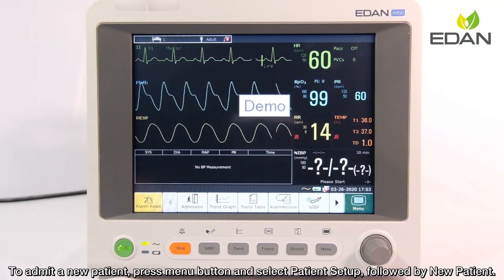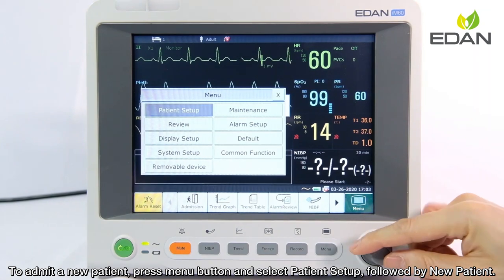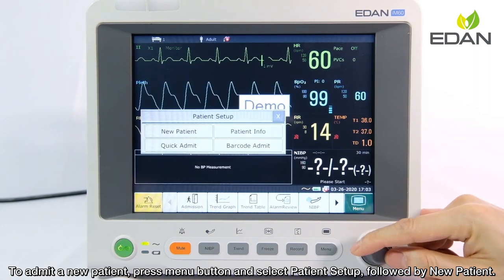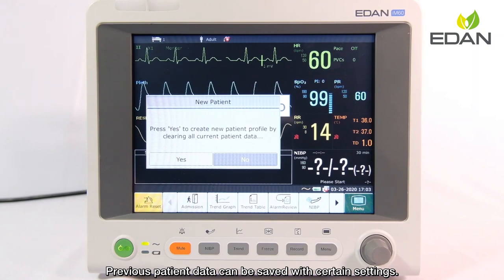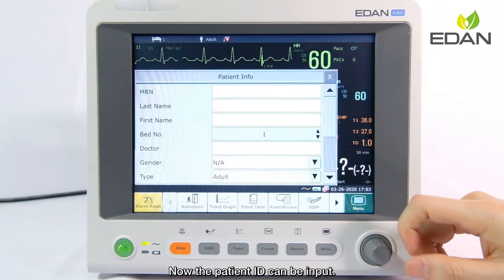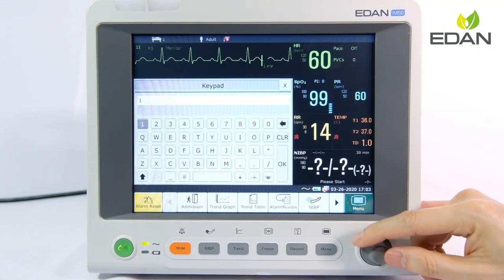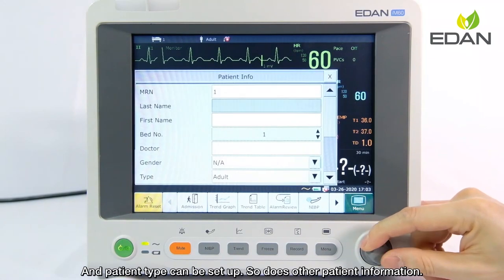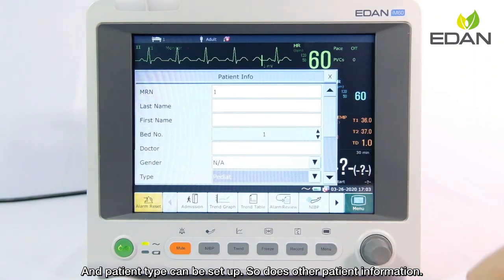To admit a new patient, press the menu button and select patient setup, followed by new patient. Previous patient data can be saved with certain settings. The patient ID can then be input, the patient type can be set up, and other patient information can also be entered.